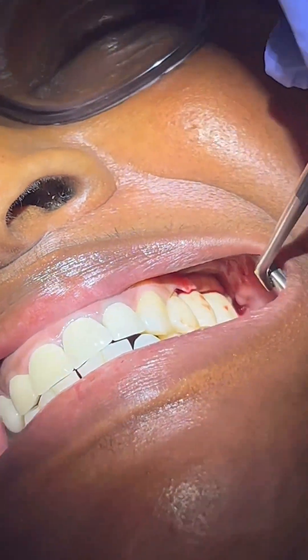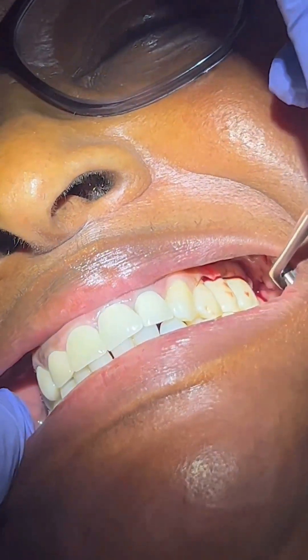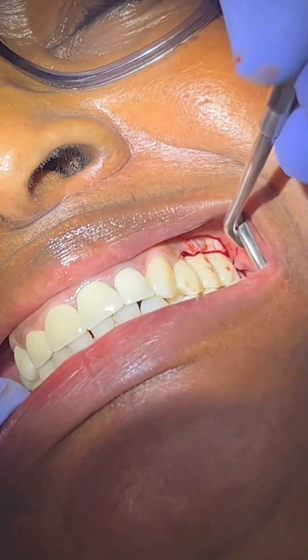Light down. Make sure it's close. Light down, stay biting. Bite on your back teeth for me if you don't mind — the other back teeth. There we go. Good. This side's hitting, so we're close. Maybe some minor adjustments.